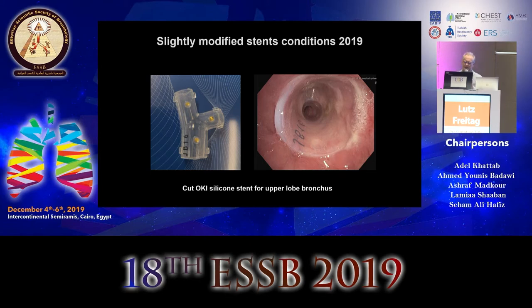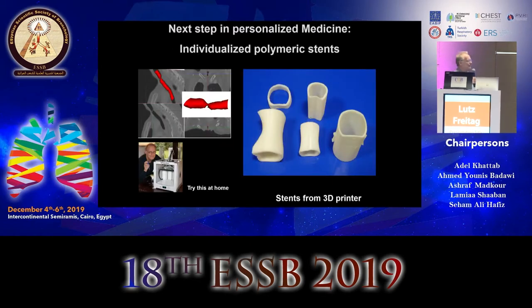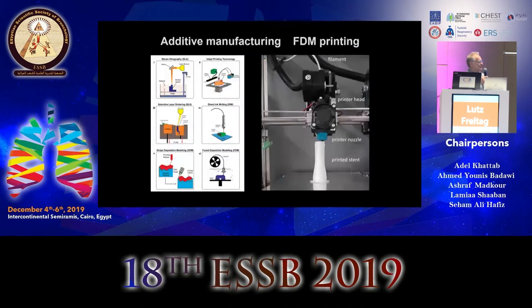Again, this is modifying an existing stent. The real step forward would be like this. You see me here with my first 3D printer and with the prototypes. With 3D printing, you can actually build a stent or whatever you like from scratch.